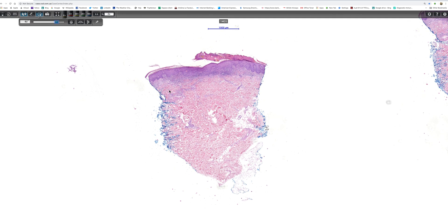I'm going to have a look at this biopsy. Firstly, at low power, we can see there's some crust present, hyperkeratosis, possibly some parakeratosis, and the underlying squamous epithelium is hyperplastic. I don't know the site of this biopsy, but I'm certain it's not from breast or nipple, nor from the external genitalia, which is of some importance when we see the histology.